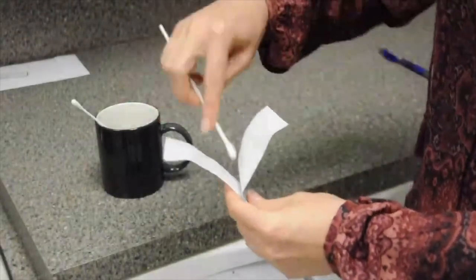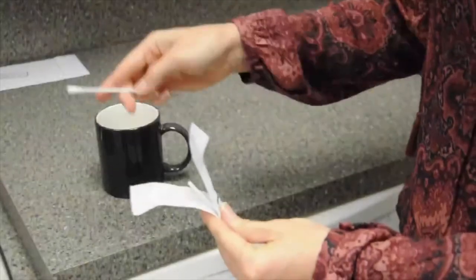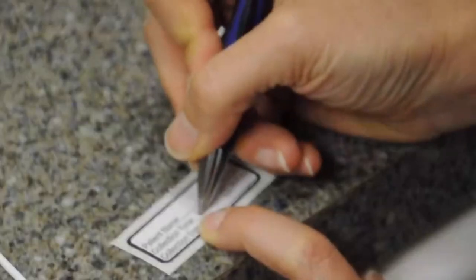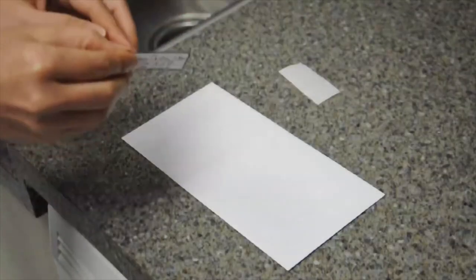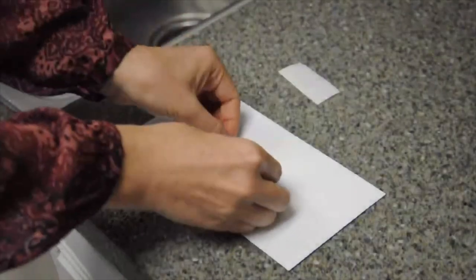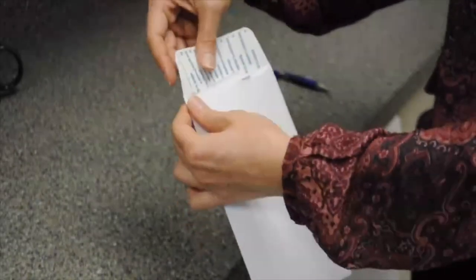After 15 to 20 minutes, replace the swabs into the applicator packaging by inserting the swab ends first. Print your full name and collection date on the specimen collection label. Place the specimen collection label on the envelope. Insert the swab applicator package into the envelope and seal it.